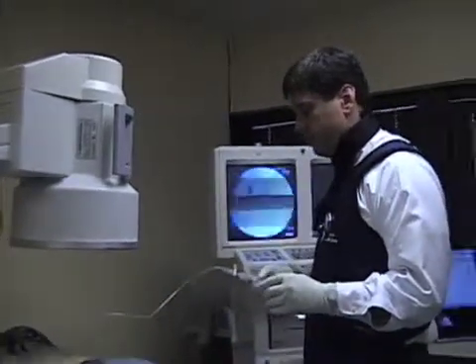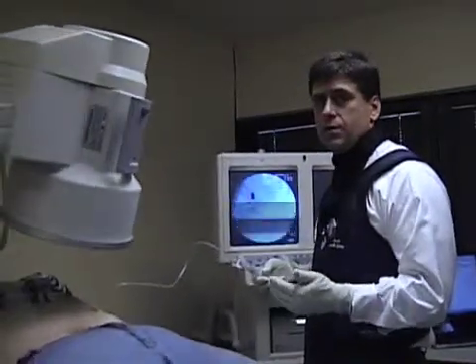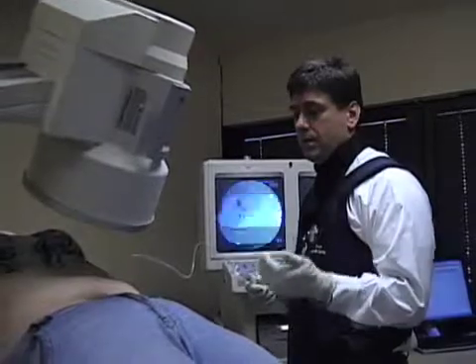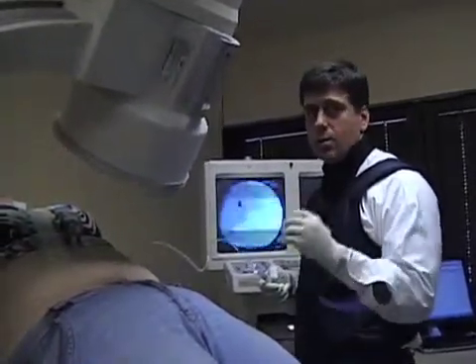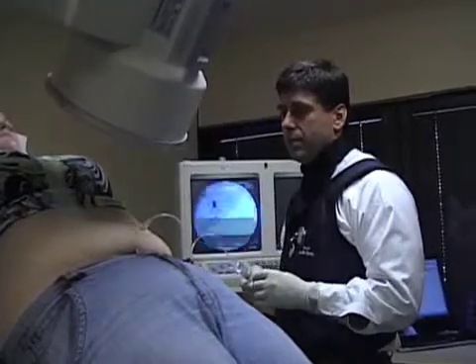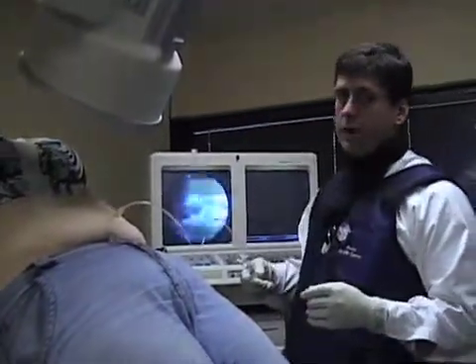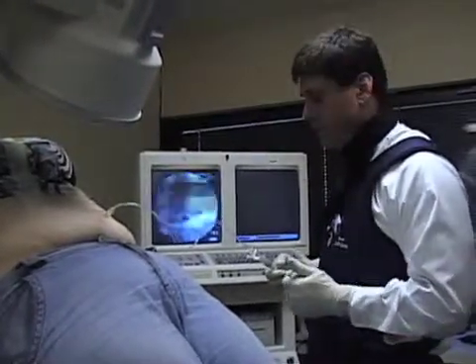We're going to stand her up. We like to do our fills using fluoroscopy — it's much more precise, it's not blind. The sticks are very precise and quick. There's no local anesthesia required, and there's no blind sticking of the port in the office. Everything is very precisely done. We prefer to use x-ray because we can see exactly what the stomach, the esophagus, and the band look like. There's no guesswork.